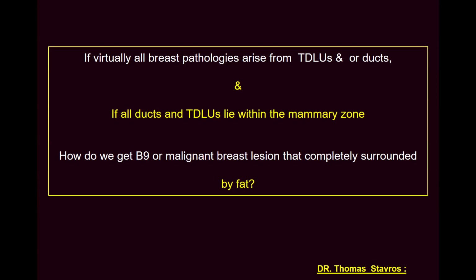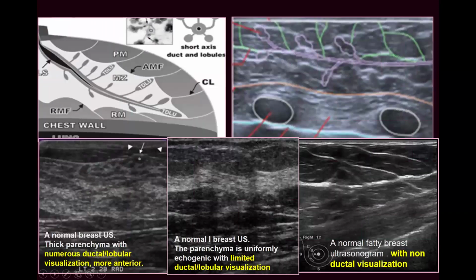From where does it arise? Do you know? Okay, let us continue. Stavros explain the reason for that.